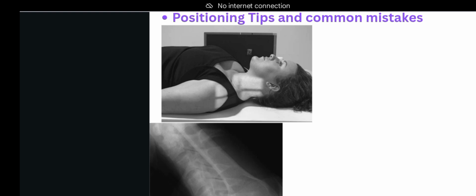This is a bulky part of the patient, so use a grid. If the patient can be aligned to use the Bucky, sometimes the table can be moved closer to the Bucky. If that is not possible, or the patient cannot be erect, then a grid has to be used to obtain a better image quality. Then exposure is done on arrested respiration to reduce movement, thereby ensuring reduction of motion and better sharpness.